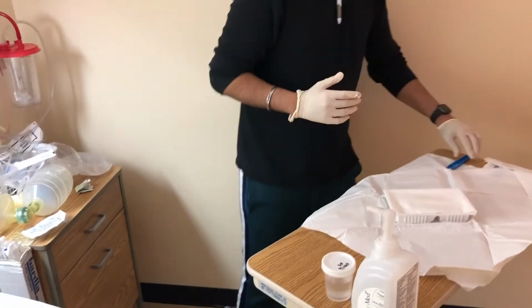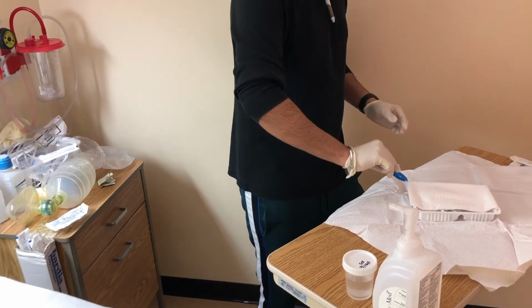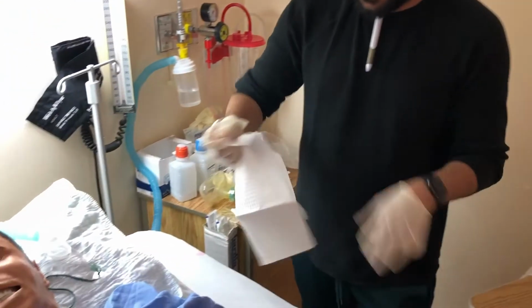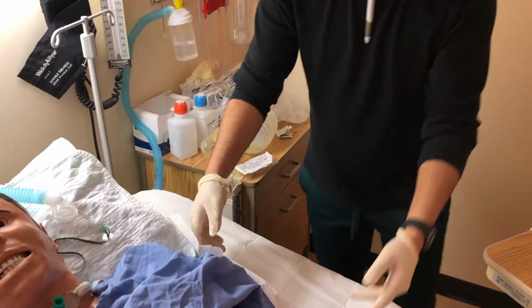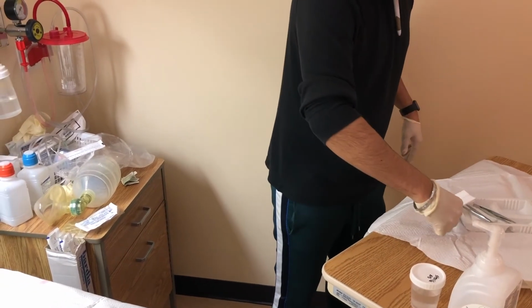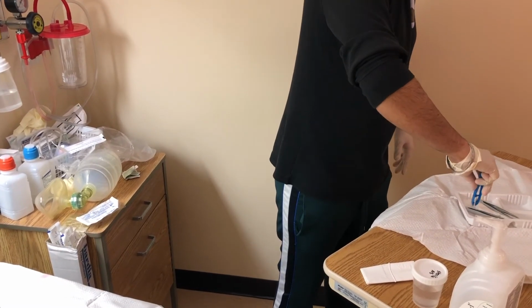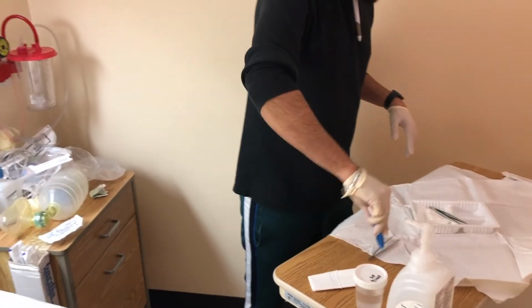So what I want to do with this portion is grab this, pass it over. I can set this up as a garbage portion. There we go, we can do that to the side.